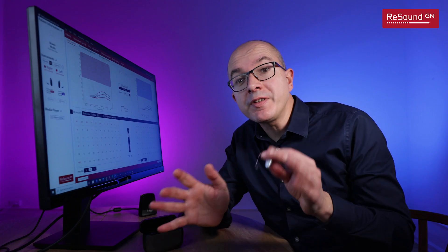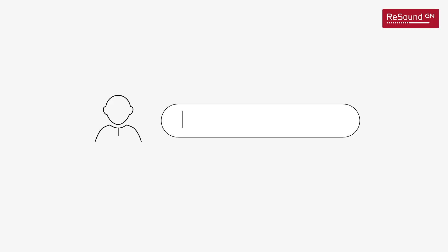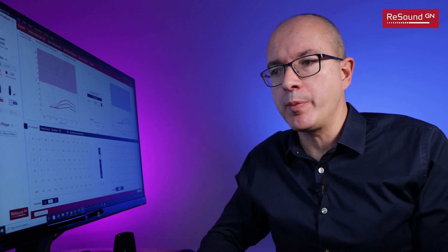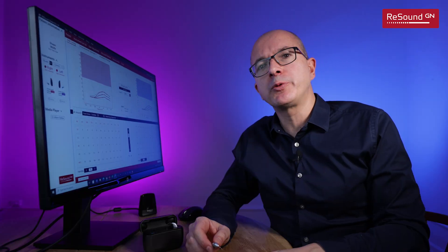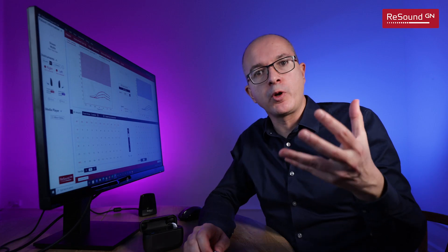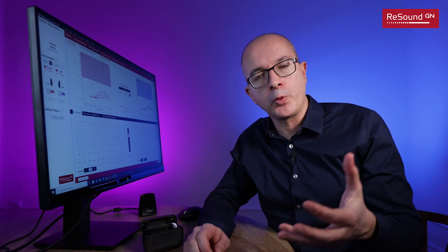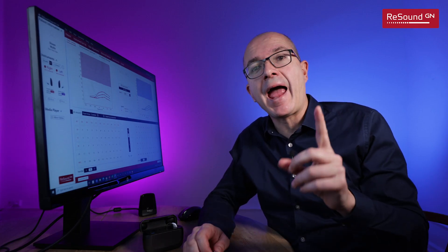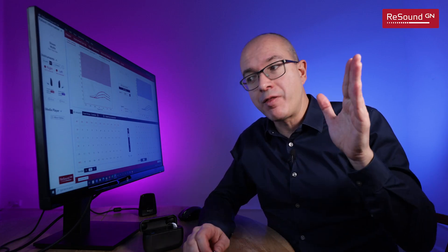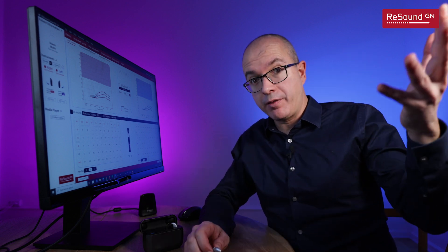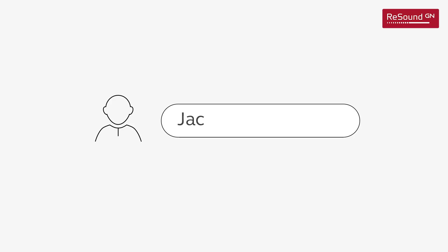In this example we are going to program hearing aids for a fictional character, and it's always difficult to find names for imaginary people. I don't want to write test test like we all do. You know what is the most common name in Hollywood movies? It is actually Jack and the most common surname is Smith. So here you go, Jack Smith is going to be the name of our patient.